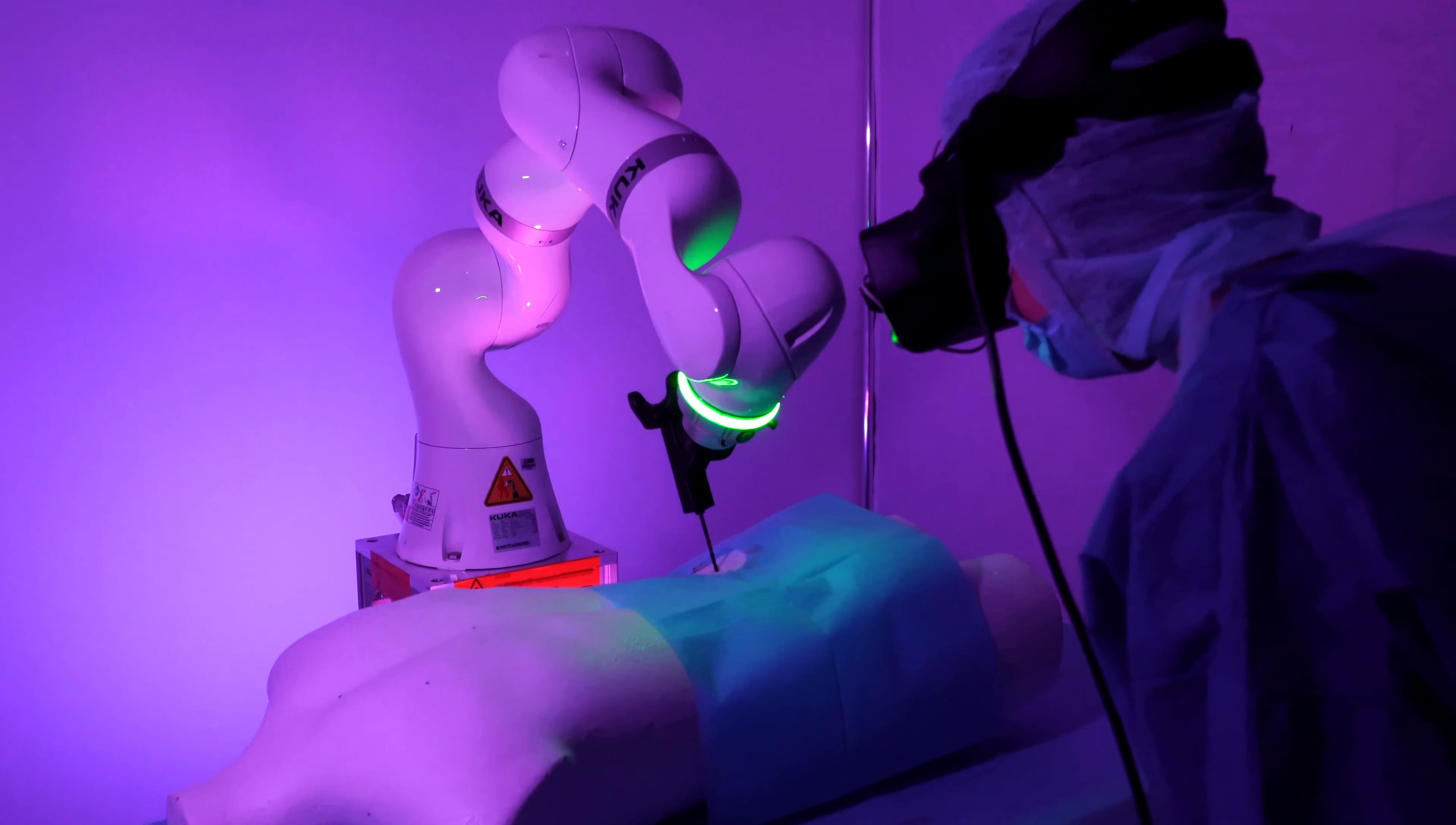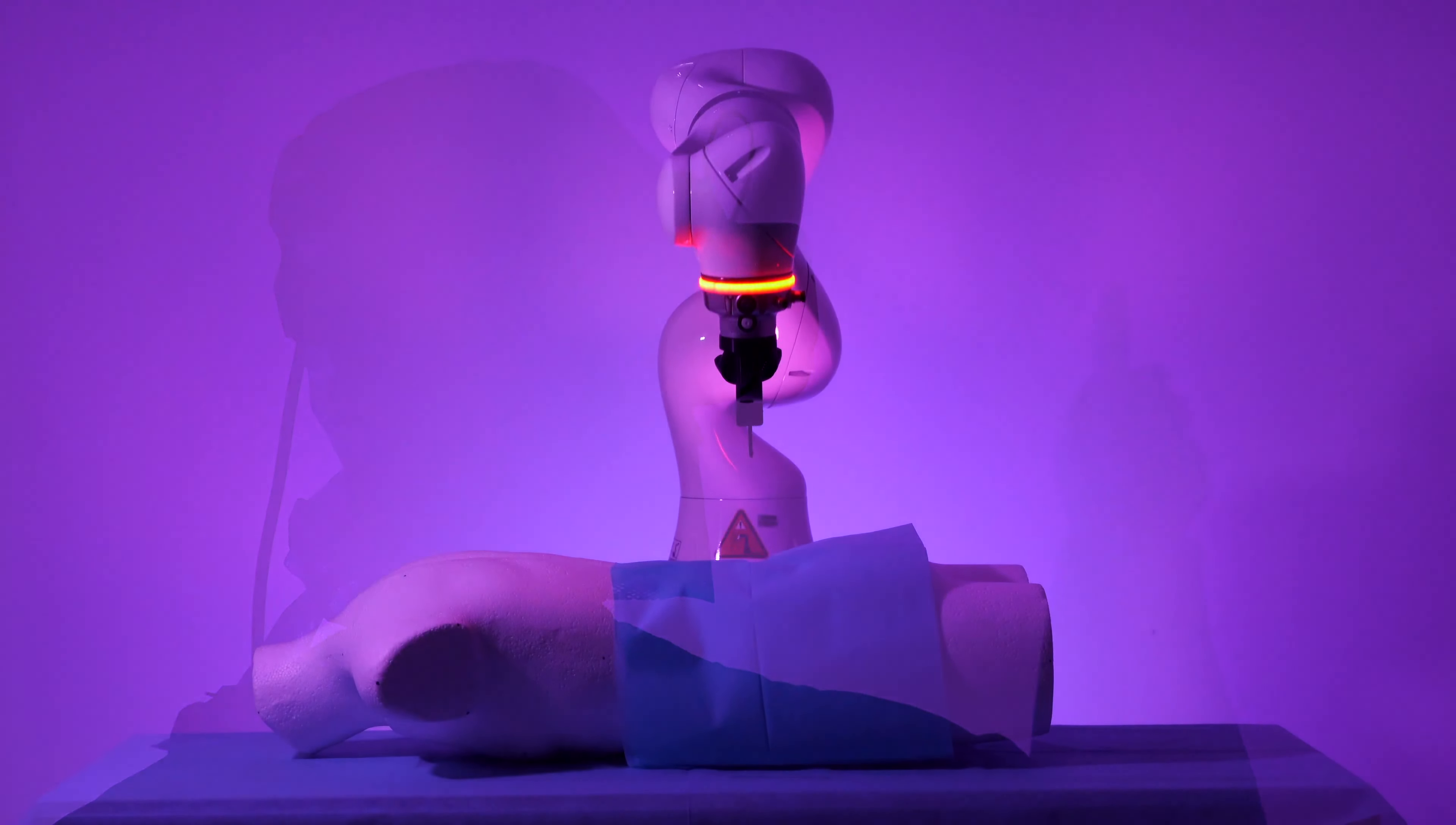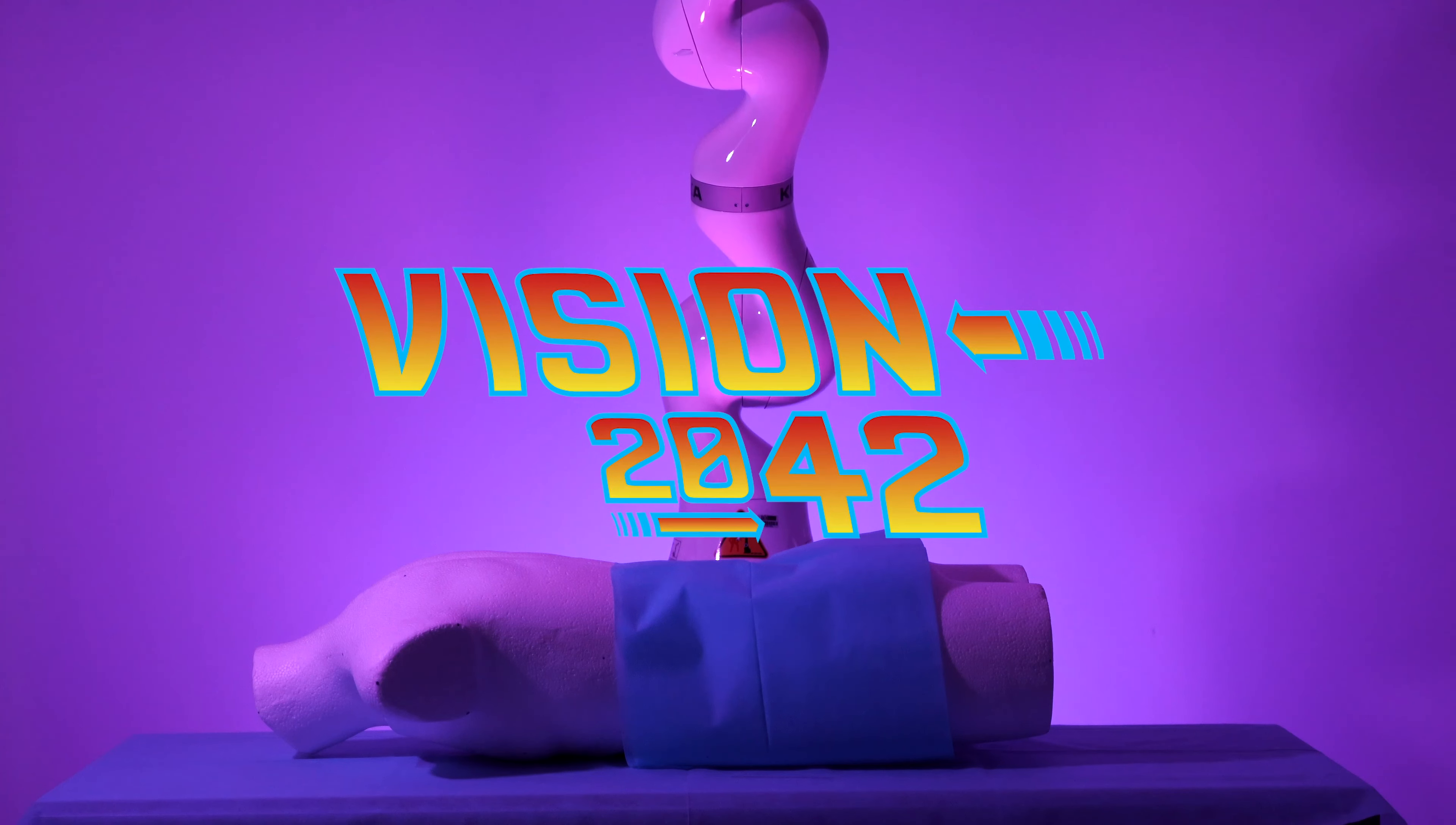Our demonstrator shows the AR system during two example surgical steps. The concept, however, is intended to be applicable to the entire surgery and in principle to other procedures as well.